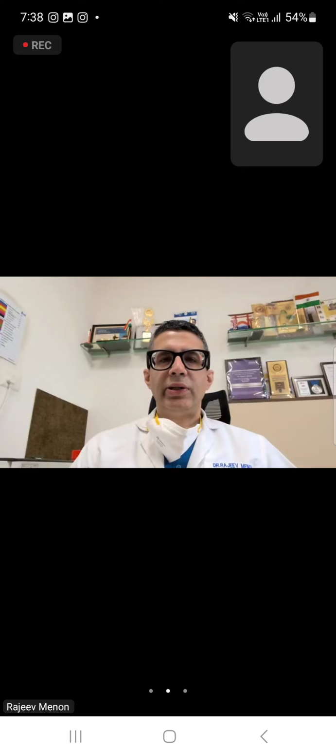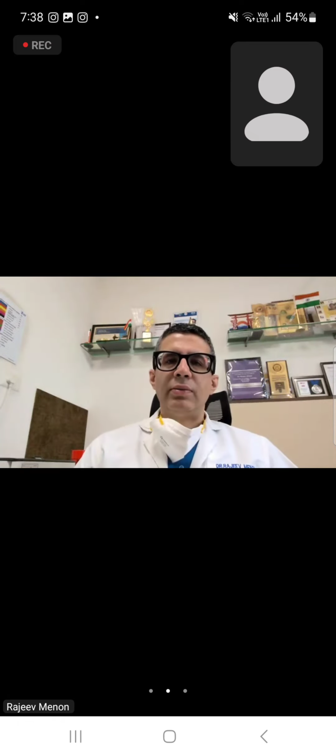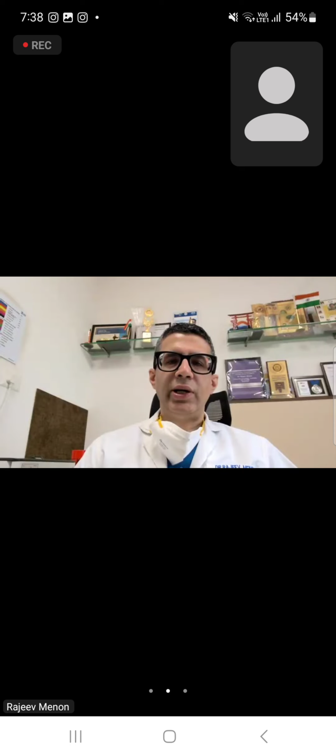Sir, do you want to comment on the question about identification of ventricular hypertrophy in the presence of bundle branch block? You are on mute, sir. What is the question? How to determine left ventricular hypertrophy and right ventricular hypertrophy in the respective bundle branch blocks?